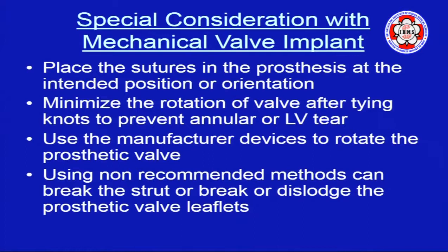To this day, I have not seen that in my practice. I have a 70% practice of all valve surgery, and a significant part of my practice, I still implant mechanical valves. I'll tell you the reason why. So far, I have not dislodged a leaflet because you have to pay attention to all those subtleties of this operation.